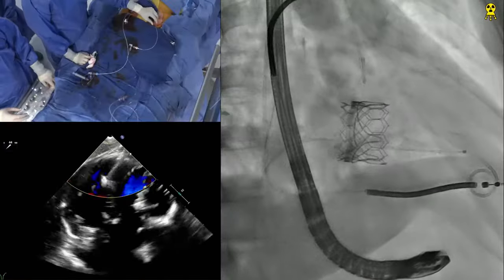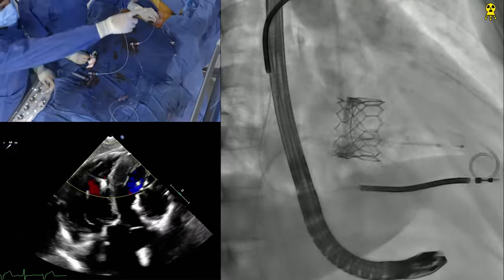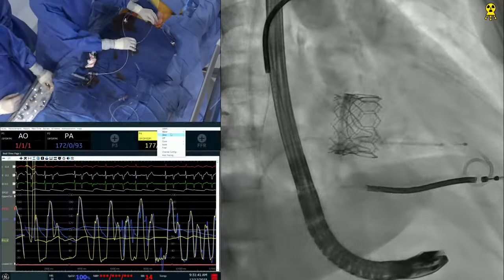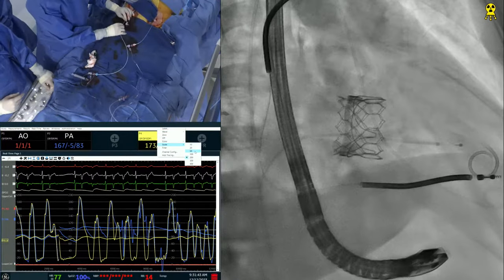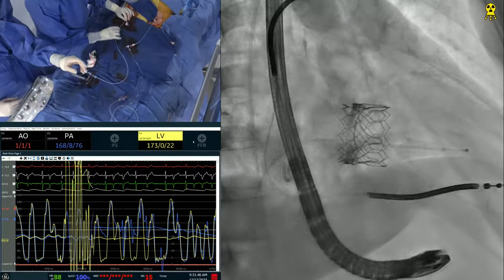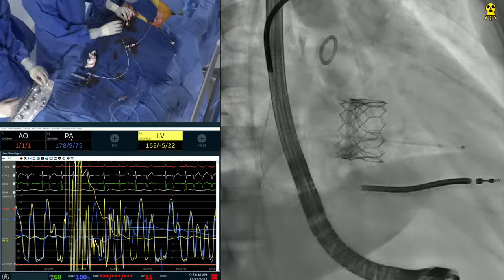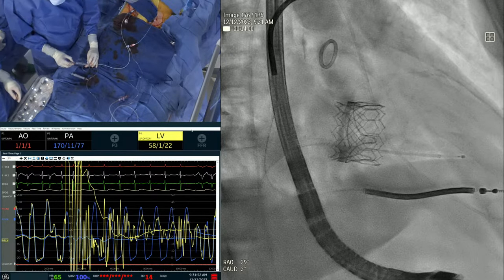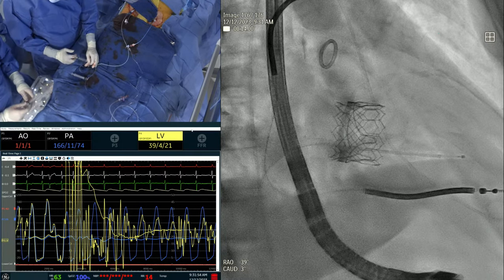Very quick. Measure for LV. Continuous Doppler. Pull this down, one back into the continuous Doppler. Show the hemodynamic tracings also. Ready? Yeah, good. Okay, that's it. Show what you need to do. Go to 50 scale. Okay. LV, LA again, both 50 scale.